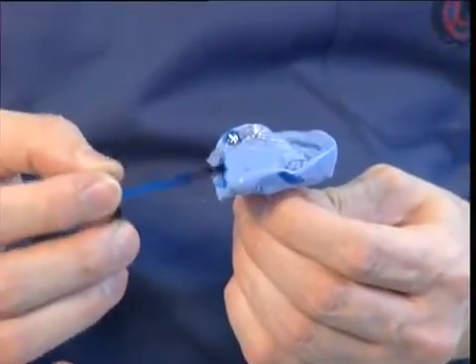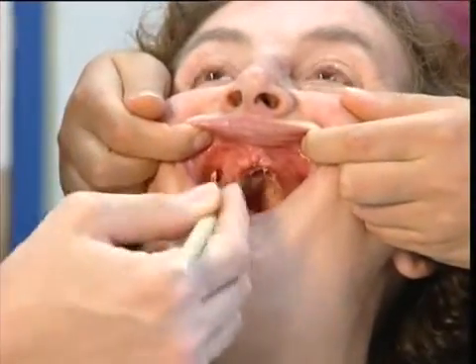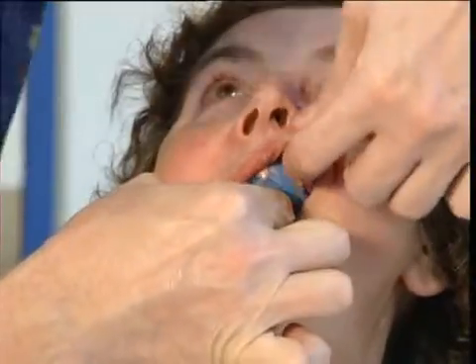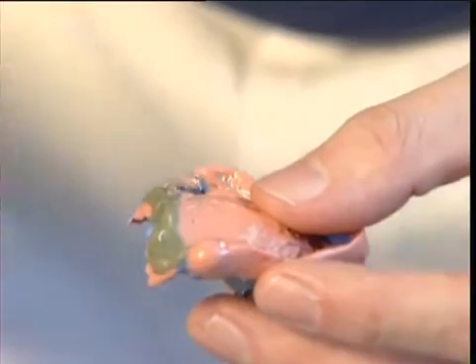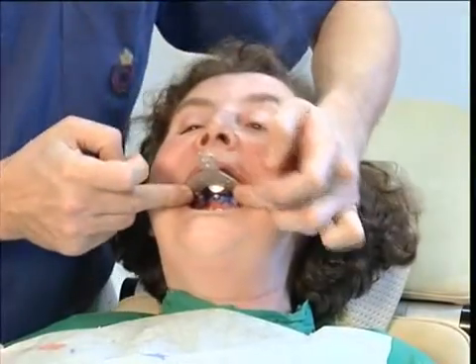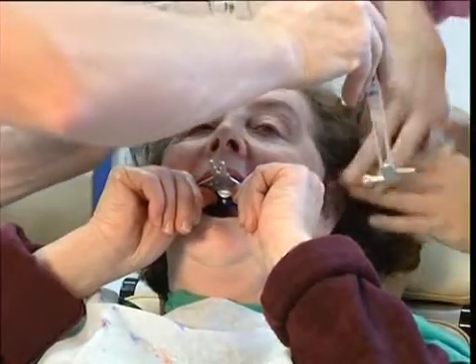A new coat of adhesive is added to the reduced areas, pink wash material applied, and a second wash impression taken. Finally, an impression is taken of the palatal vibrating line with composition. Now that the optimum suction has been created between the tray and jaw, it can be used for transferring the cranium-axis relationship to the articulated upper model anatomically correctly.